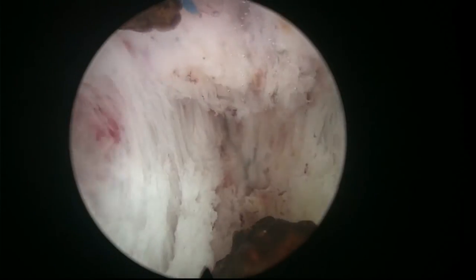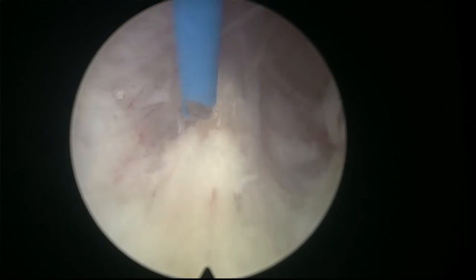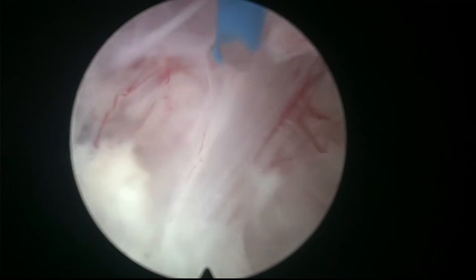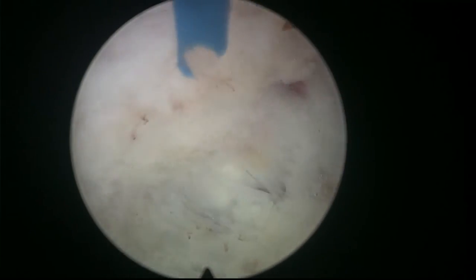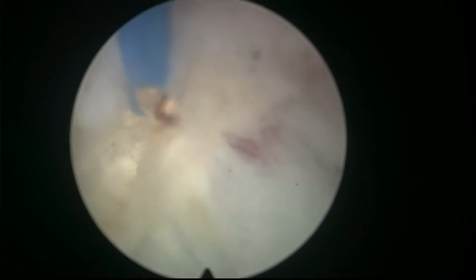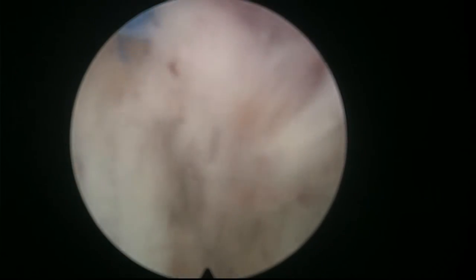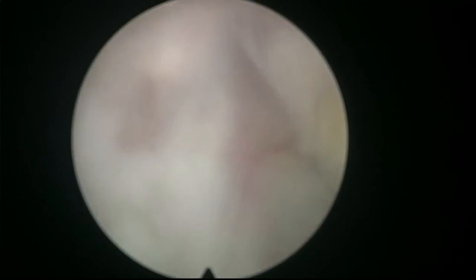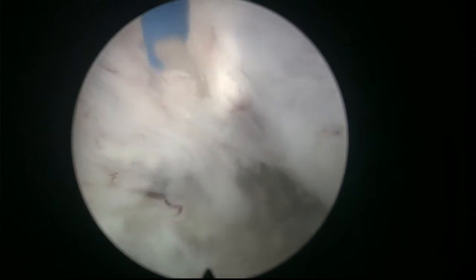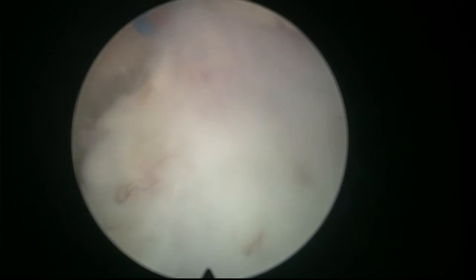You can see the posterior apex has already been dissected off the capsule. Sometimes you don't want to leave adenomatous tissue there, so you have to get your references right. Sometimes I go a little bit inside to check. Initially I like to cut the surface of the adenoma — here I'm not looking for the plane, I'm looking to dissect the apex of the sphincter. Then we'll go and look for the right plane carefully. When you go a little toward the cranial aspect, things get clarified.